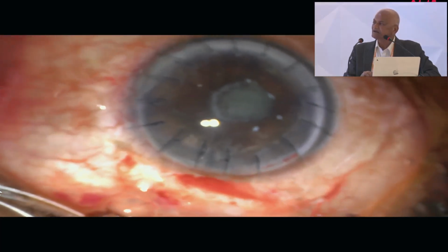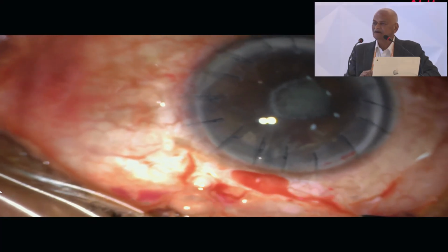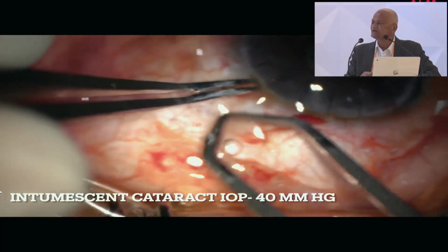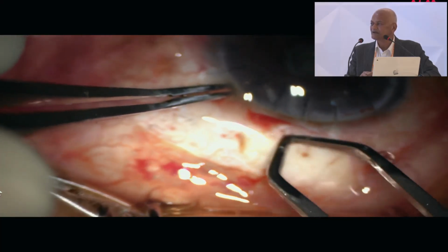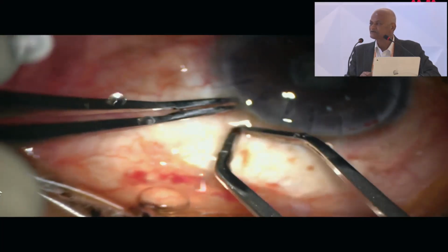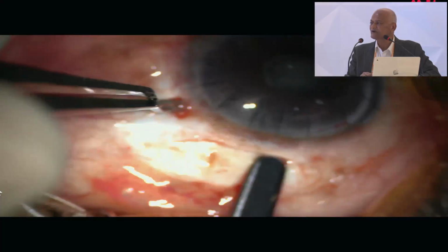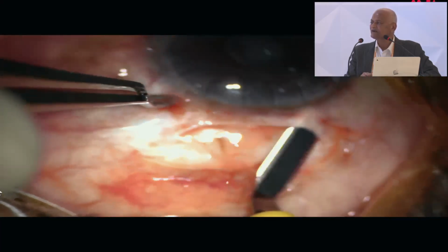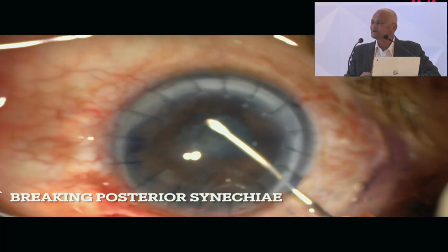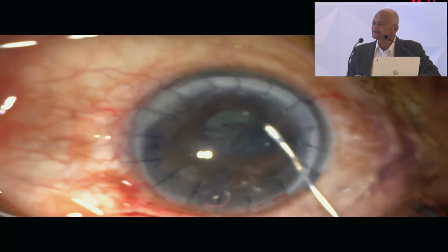Now see here, it is a keratoplasty, and after that I am doing the cataract. Here again you will have to go behind where the sutures are not there, otherwise the sutures will get ruptured, and then you will have to take sutures there also. So whenever I am doing it, I am going behind and trying to see here. Now the sutures I have kept, and after the sutures I am doing the rexis.